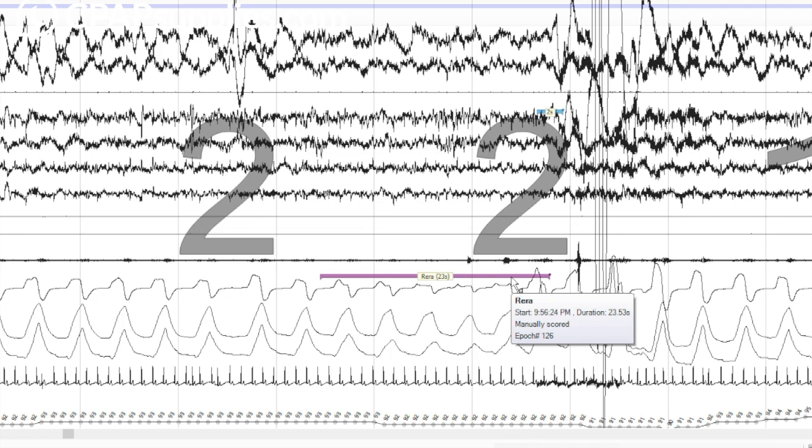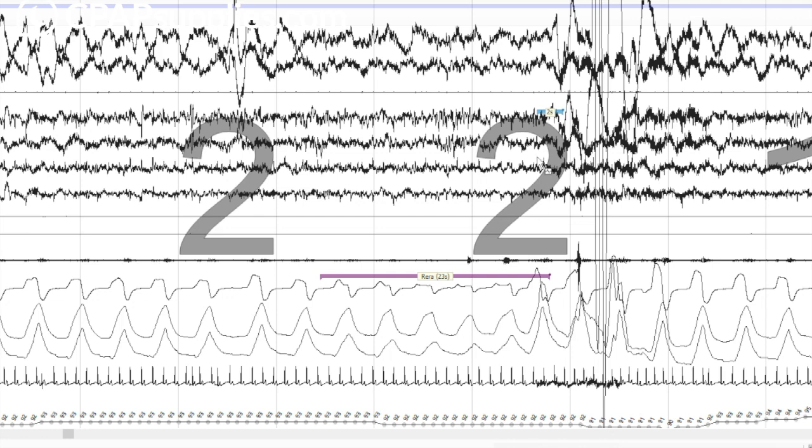This does not meet the criteria for a hypopnea though. So it would be called nothing. This would be called a spontaneous arousal. But because I flag RERA as it is something, it's gonna count towards the overall thing. And then if they need, this is obviously a breathing problem, right? So if you inflate this with CPAP, it really disrupts sleep a lot. That's all I want to say about it. I'll stop beating the dead horse.